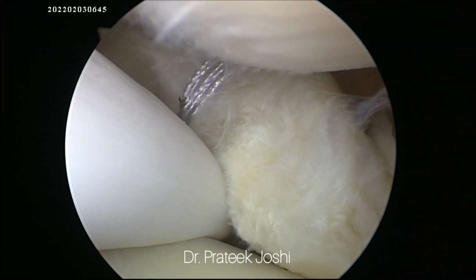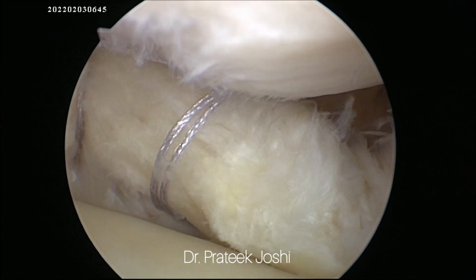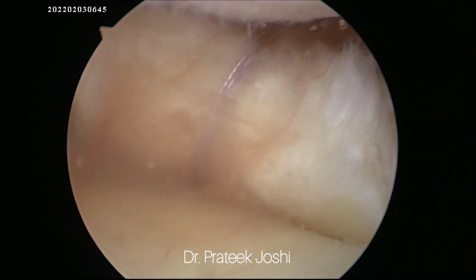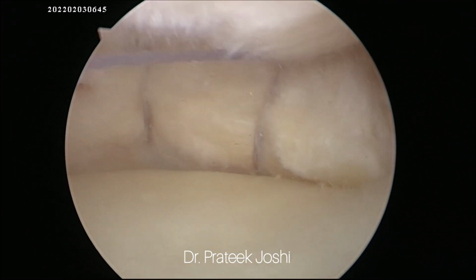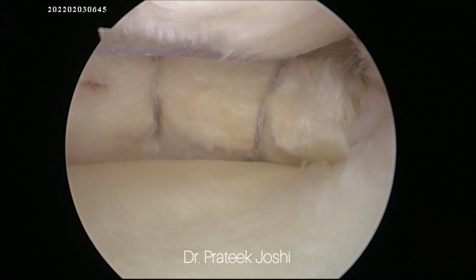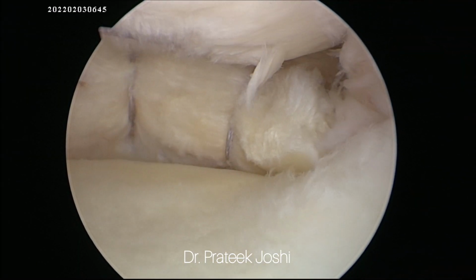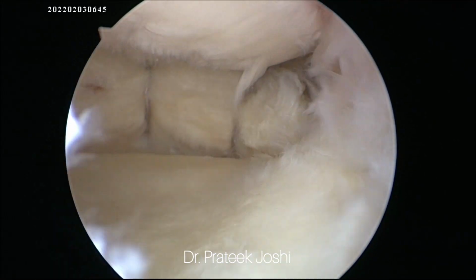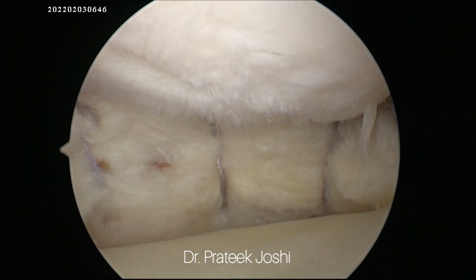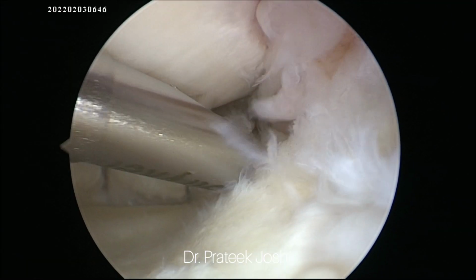So now the second device is being deployed, and this completes the third stitch. And as I'm tightening the stitch, this is going to reduce the meniscus. You can see that the root is intact, so we don't need any root repair in this patient right now. And we are going to cut the thread, and this is going to complete our three stitches that we have used to repair this meniscus.